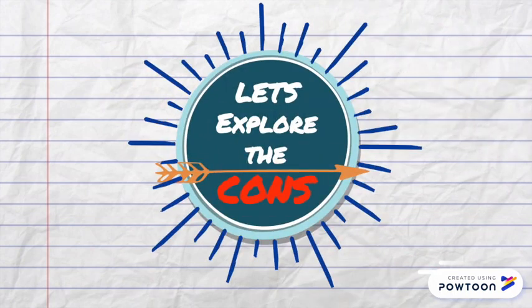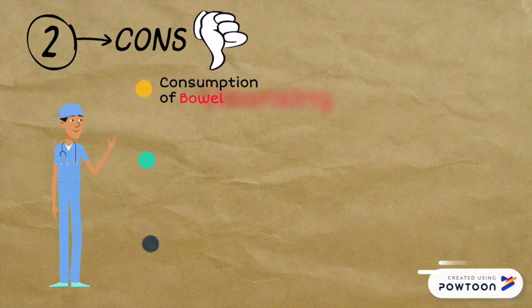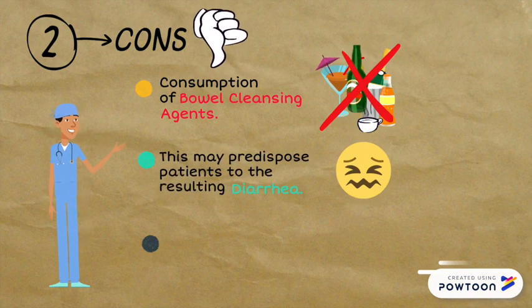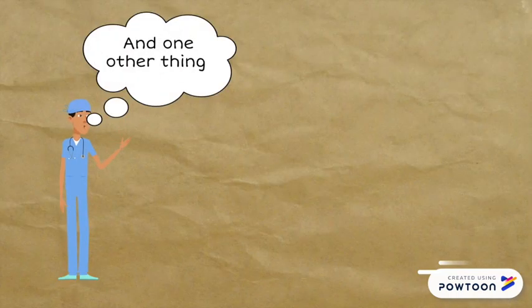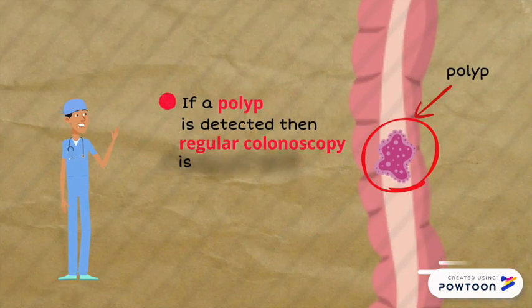Let's look at the cons. A large portion of the disadvantages is related to the consumption of bowel cleansing agents that predispose patients to the resulting diarrhea. Coupled with this is the radiation exposure involved in the procedure. And one other thing, if a polyp is detected, then regular colonoscopy is required to remove the polyp.